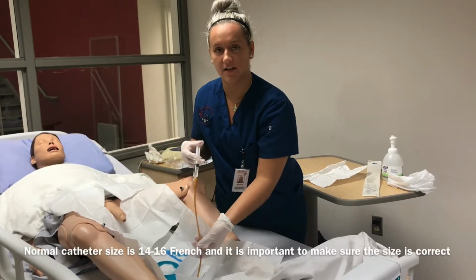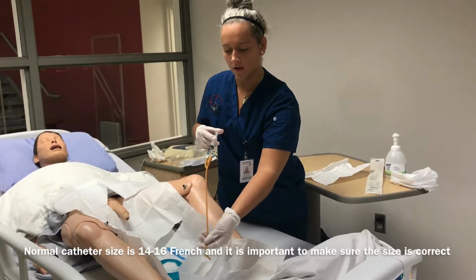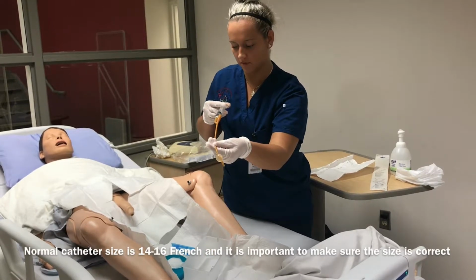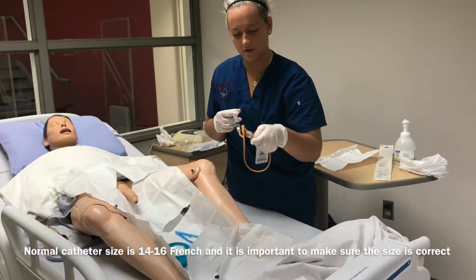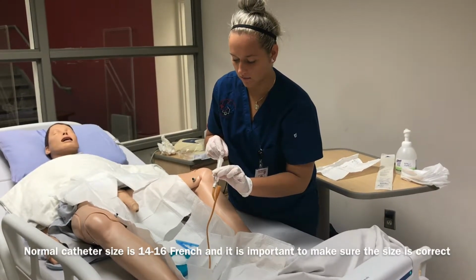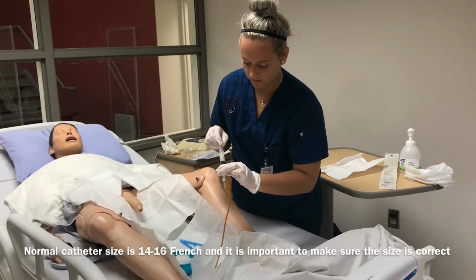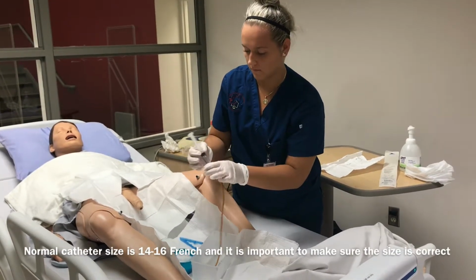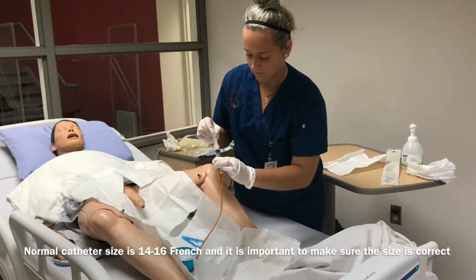And this is just to make sure that the catheter is functioning, and so you're going to want to slowly push on the syringe and watch as the balloon inflates. So as you can see, the balloon is starting to inflate. And then you inspect the balloon, make sure that there's no leaks or rips. And then you can just take the water or the saline solution out and make sure to do this slowly.